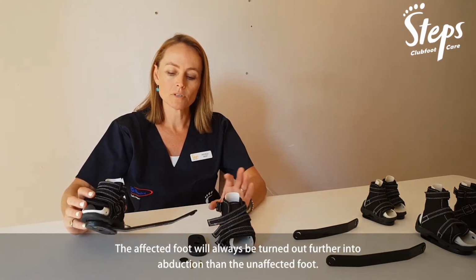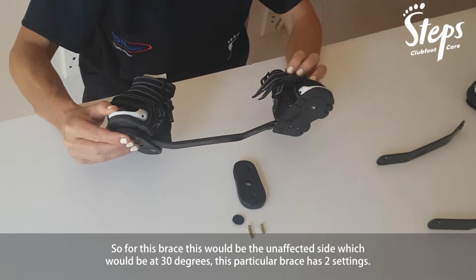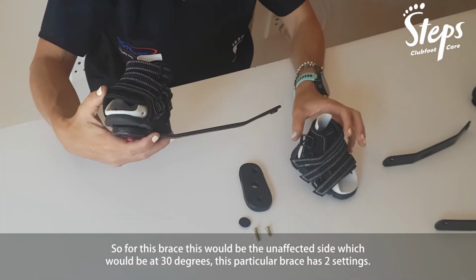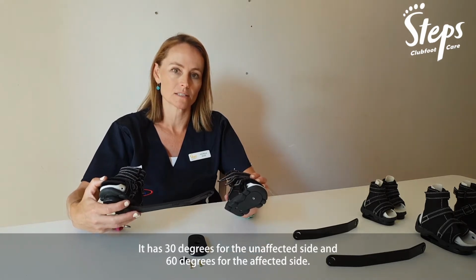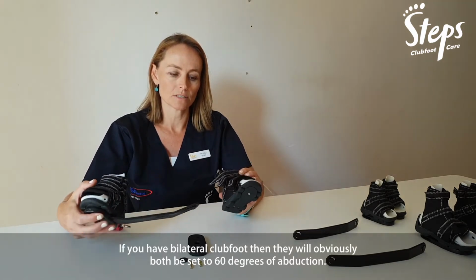The affected foot will always be turned out further into abduction than the unaffected foot. So for this brace, this would be the unaffected side, which would be at 30 degrees. This particular brace has two settings. It has 30 degrees for the unaffected side and 60 degrees for the affected side. If you have bilateral clubfoot, then they will obviously both be set to 60 degrees of abduction.